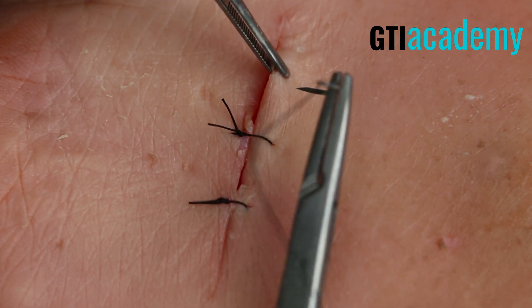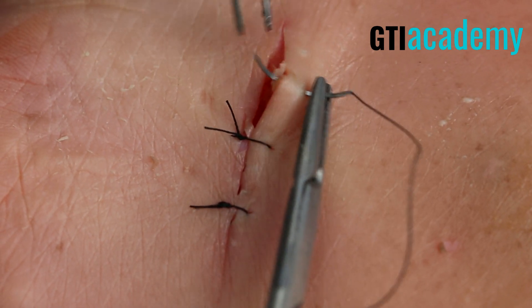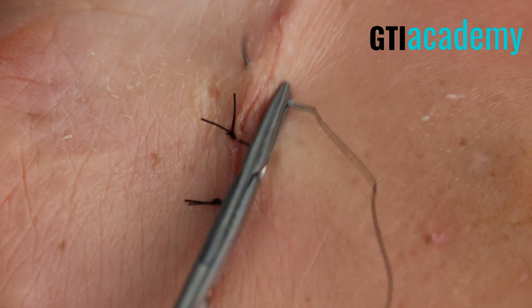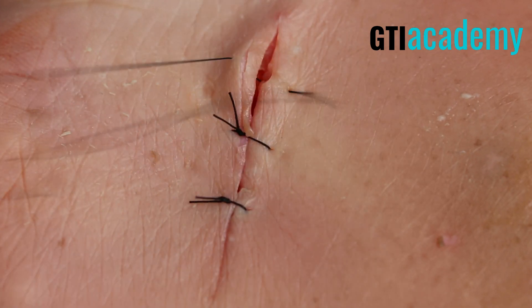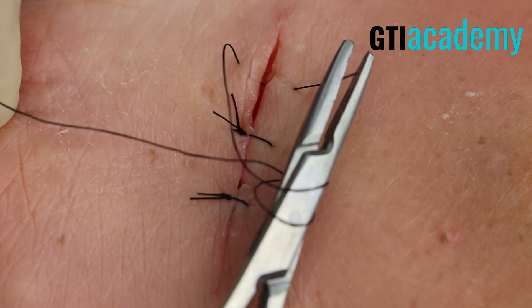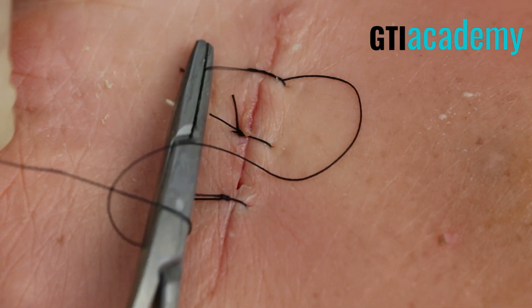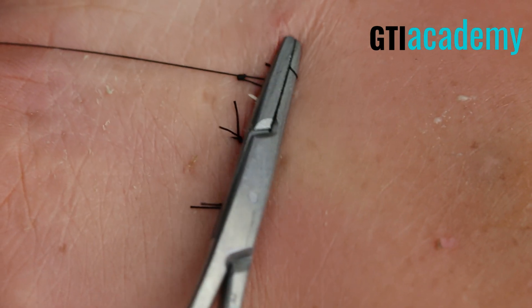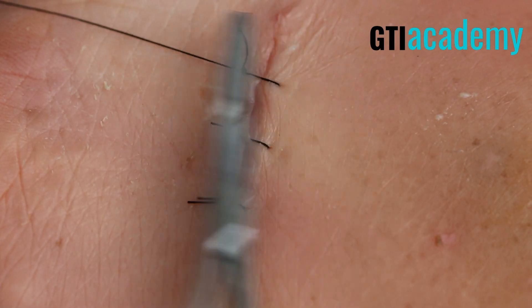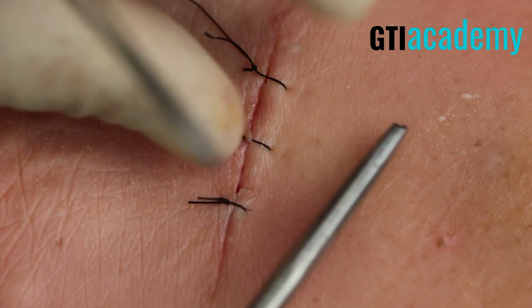Now let's move up to the top. Measure the top to the last suture, take the middle, and throw another suture. Driving — completing the circle. There we go. A suture knot will follow. Surgeon's knot twice here, then once and twice — three throws for this particular suture.